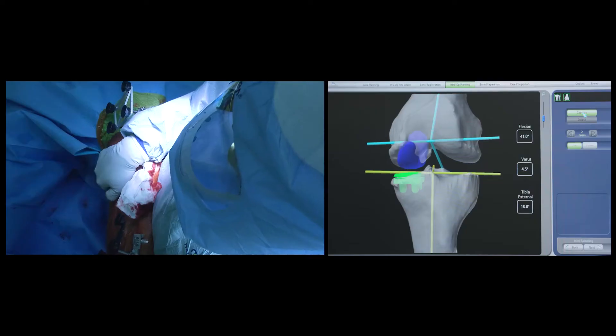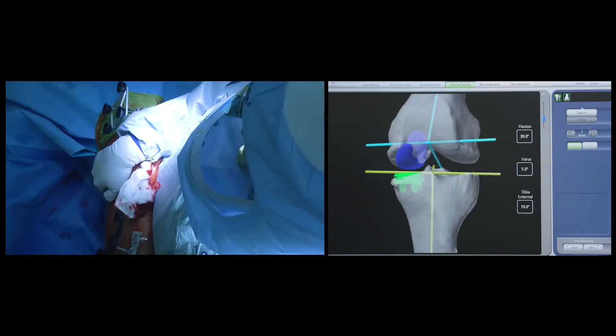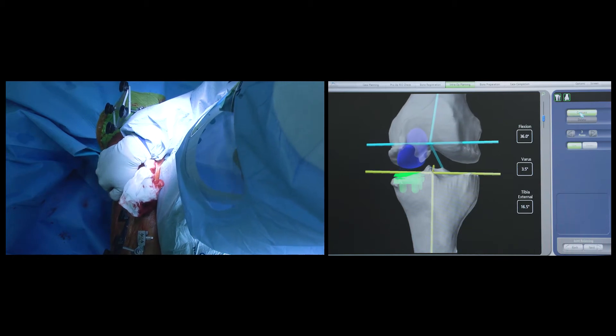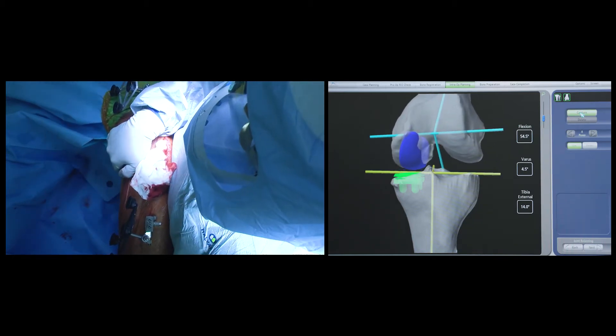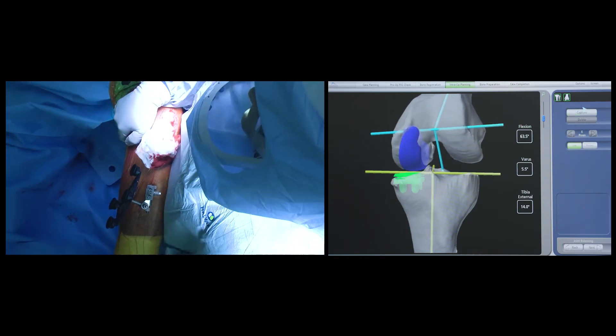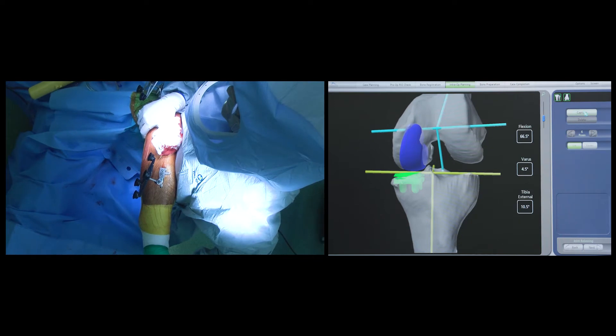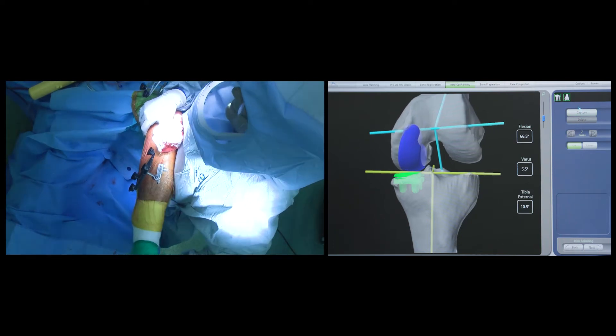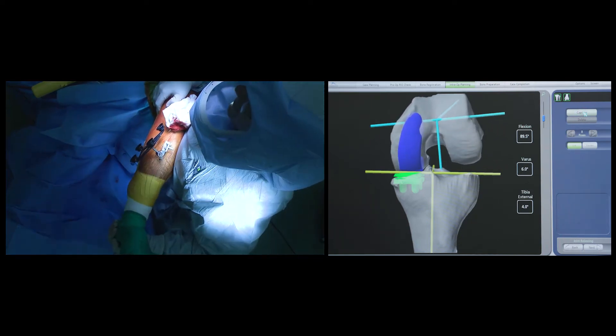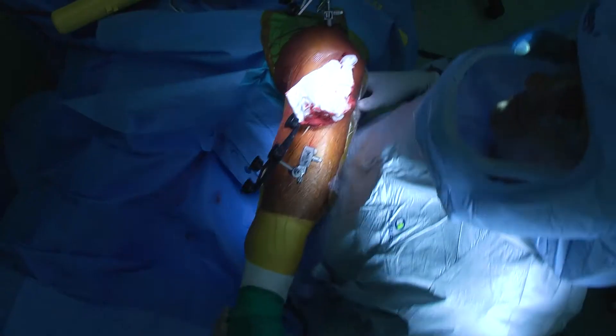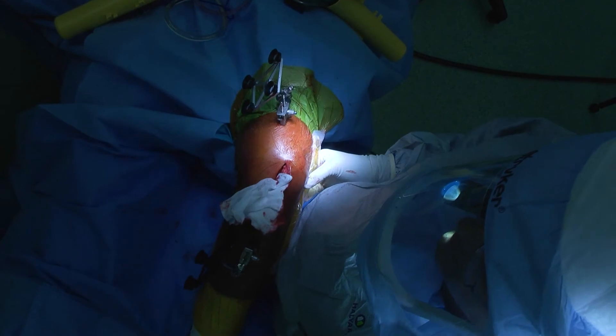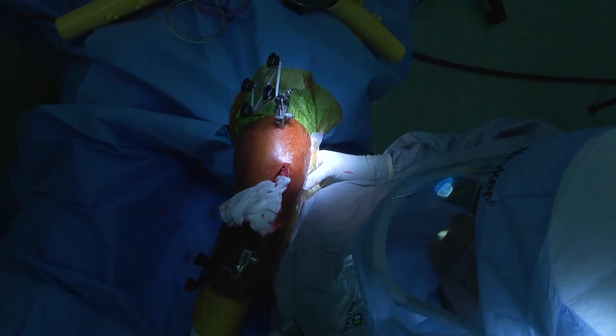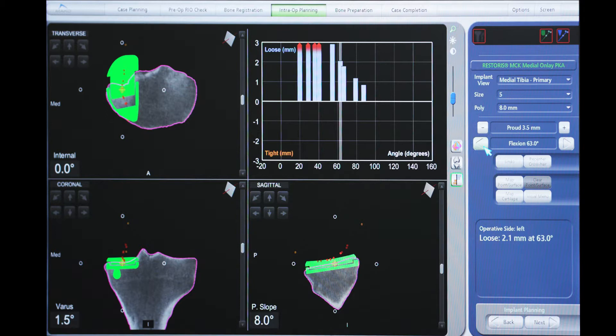What follows is probably the most crucial step in the operation. For an optimal outcome, it is paramount that the tension of the medial collateral ligament is restored throughout the entire range of motion of the knee. With this system, I'm able to measure the ligament tension by assessing the distraction of the medial joint space by applying a valgus distracting force to the knee in varying degrees of flexion. This is then depicted on the screen as a bar graph, and I can then adjust the amount of laxity or tightness of the ligament by adjusting the position of the implants or by reducing or increasing my femoral and tibial cuts.